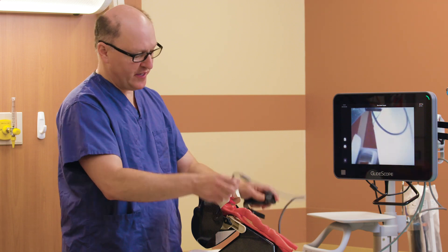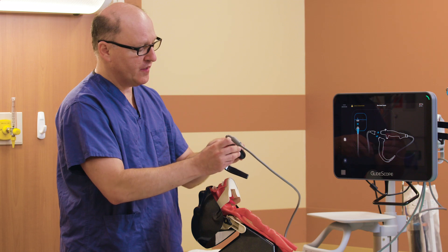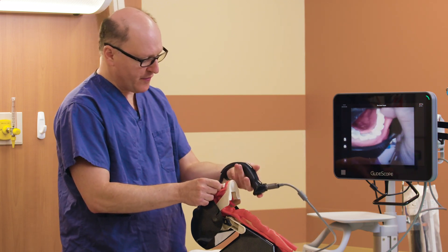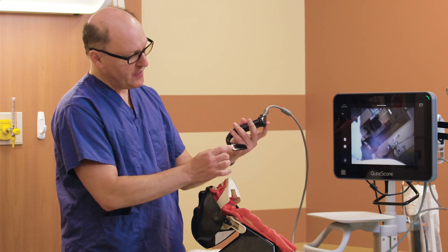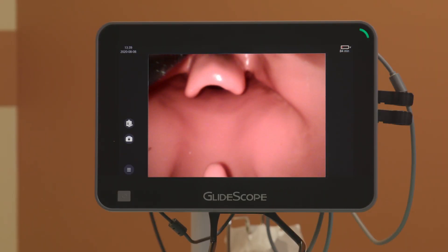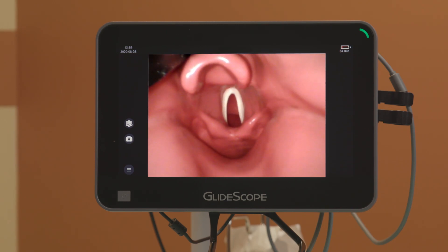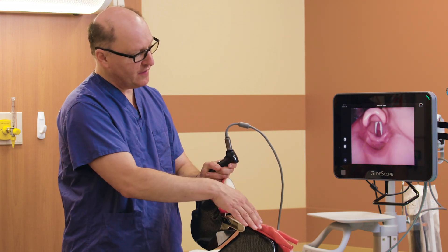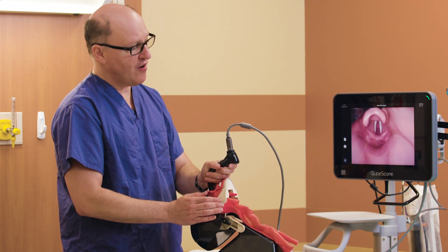If we switch this out and take a look now at the four in this mannequin, after I scissor open the mouth and roll this around, the longer distance between the video element and the tip means we engage the vallecula earlier and as we come backwards there is a tendency to over-insert. Now we have a very acute up-angle, a very acute approach angle to the trachea, and tube delivery can get harder.